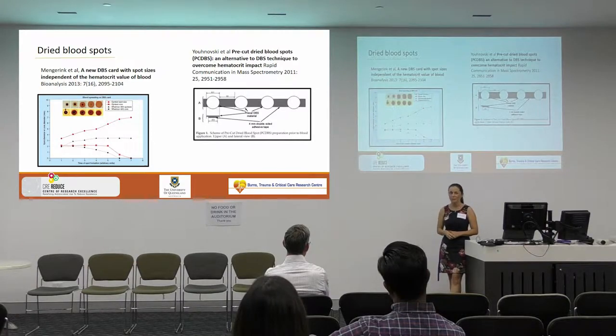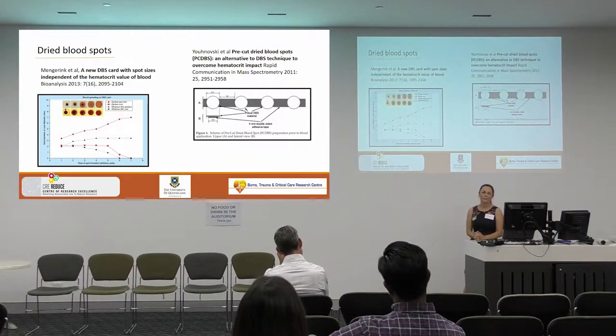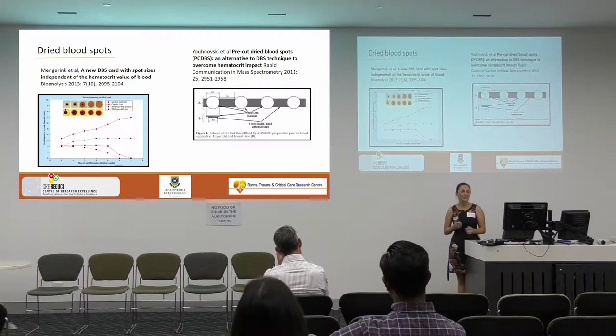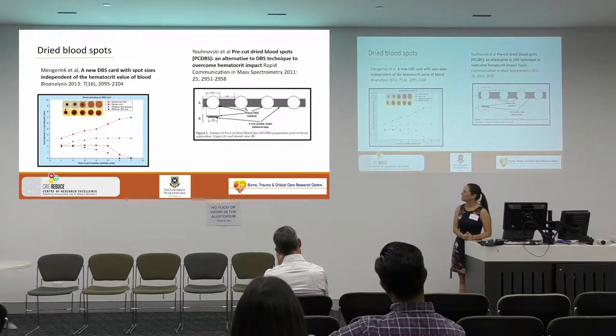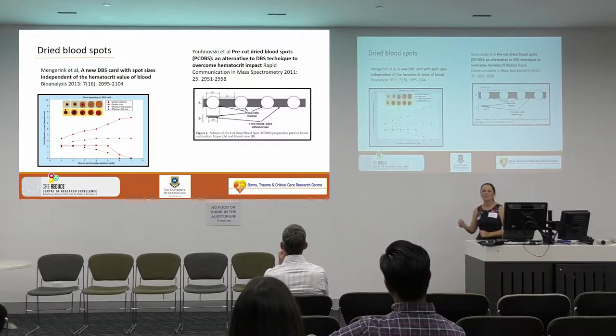This reminds me a little bit of when I came out of university, and I worked on, someone was trying to design a titration system, and it was being held together with gaffer tape and paper clips. You'll see that what they've got here is they've got their dry blood spots, and they've stuck it to some adhesive tape, and then they're applying their blood from that. But it's a start, and we'll see how it works. Certainly across a hematocrit range of 25 to 75%, they saw a precision of 3%. So there's certainly something in the idea.